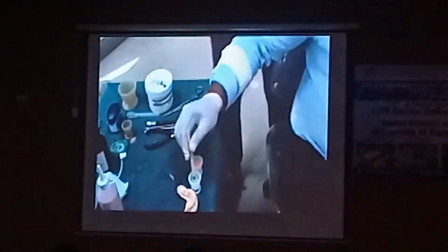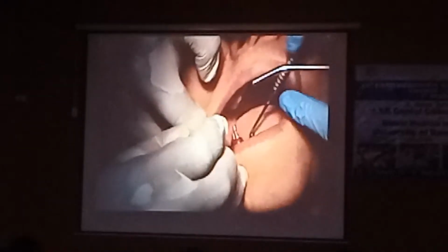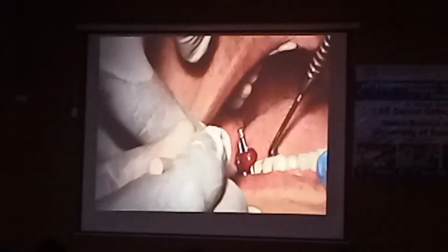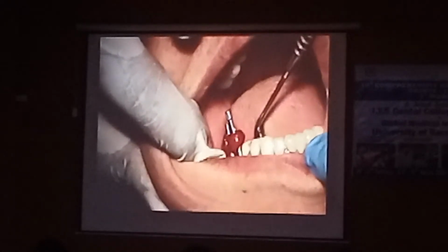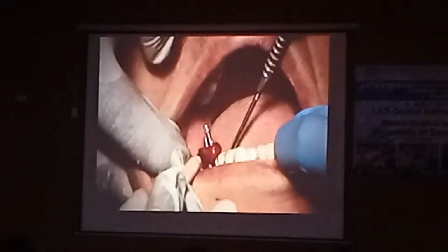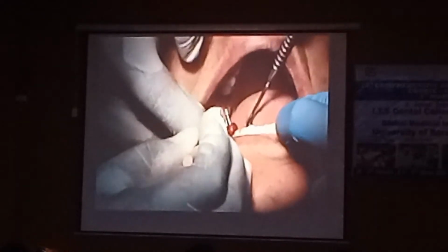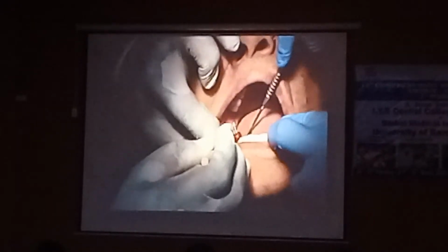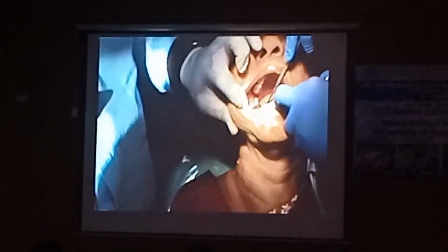Either I use a pattern resin like I used last time, remember? So I can do it in the same way. But now I have to build up only this part. Right? So it is definitely going to be much faster.